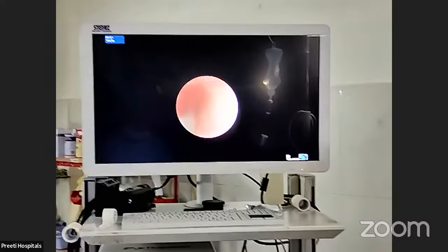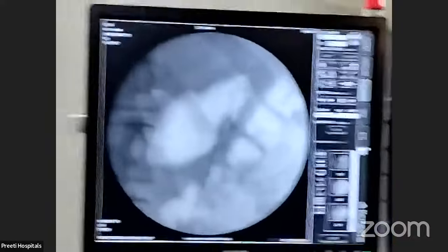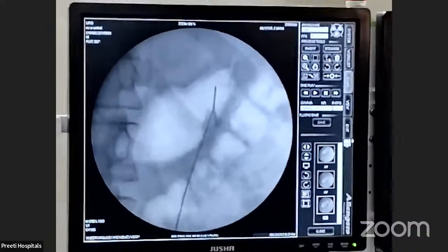Now you come back. And now you have to use the C-arm in this. Please use the C-arm where it is. See, it is coiled inside. Don't remove this at any cost. Now what I will do is, don't show the backs of the surgeons, that doesn't look nice.